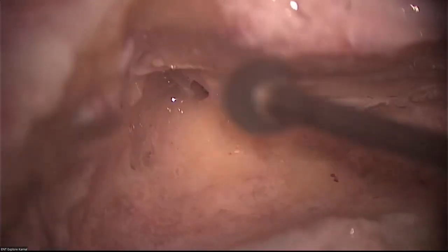So I am thinning a little bit to give more tilt. This is thinning of the canal wall. See, this is thinning of the canal wall.